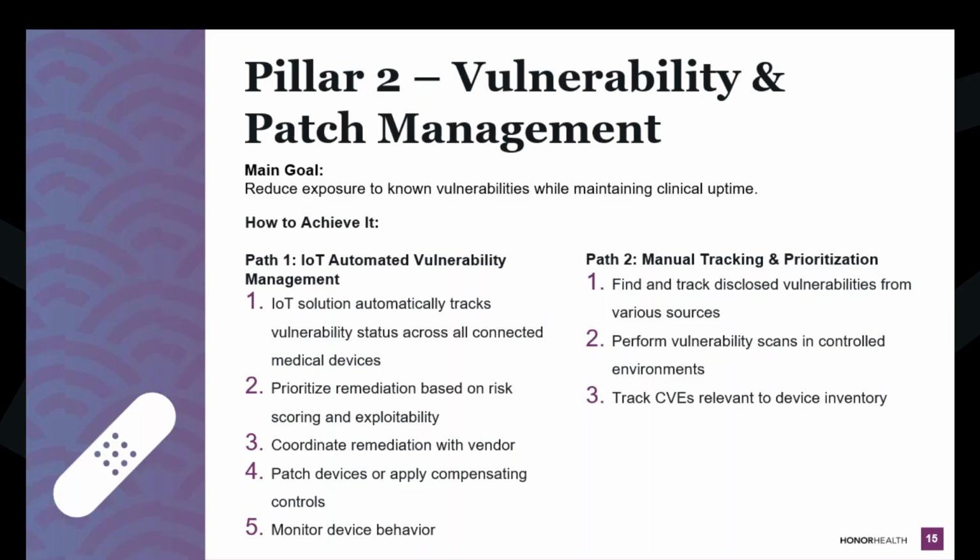And then you need to find a way to track all your vulnerabilities, right? It could be maybe in your CMS if it's robust enough. Maybe you're tracking them on a spreadsheet, but you're going to track your vulnerabilities against your device inventory. And then you're going to manually evaluate the risk of those vulnerabilities. So how do they score up against each other?